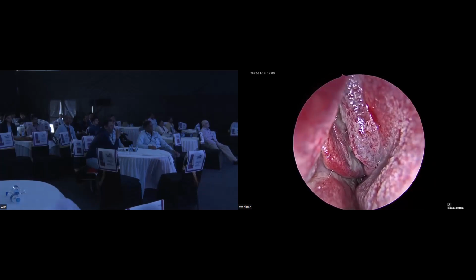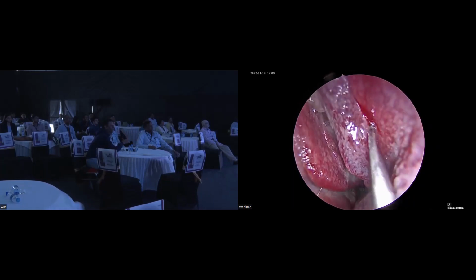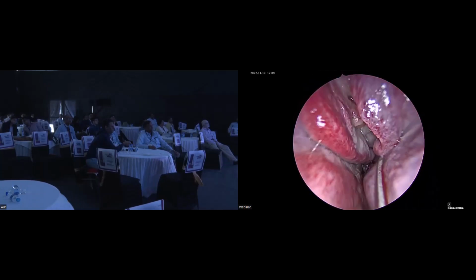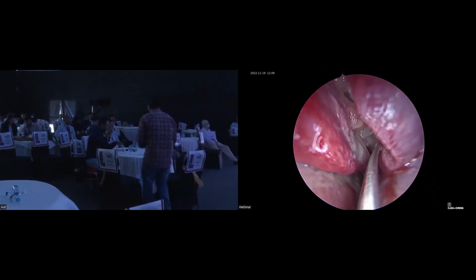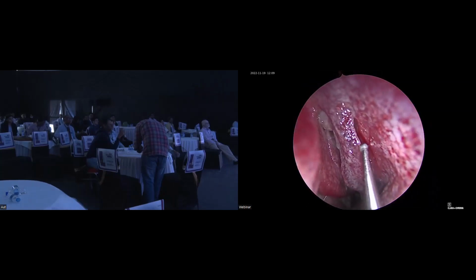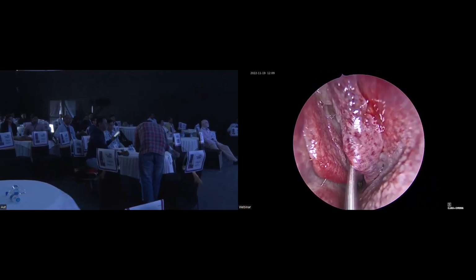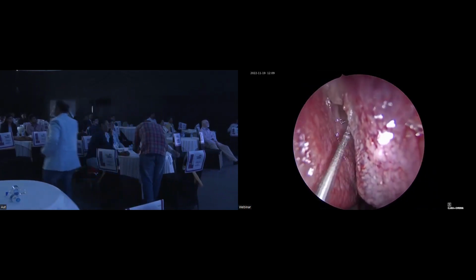Madam, anything in the pre-operative, you will prepare the patient few days prior to surgery? Every patient scheduled for surgery, we always give a good course of antibiotic and steroids. I start preparation minimum 2 weeks prior, so that when we are operating, we have a good field and inflammation is taken care of. Here you are seeing that the uncinate process is almost polypoidal, but the polypoidal part of the uncinate is resolved dramatically after the course of steroids.